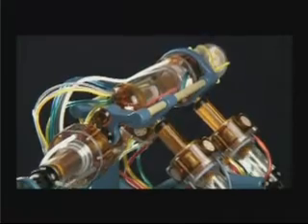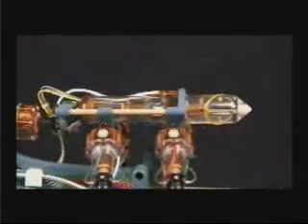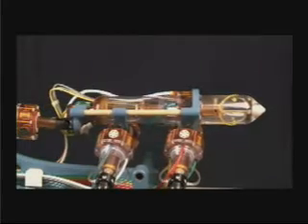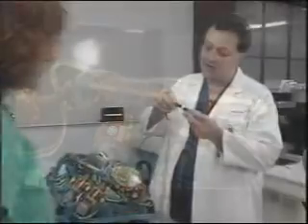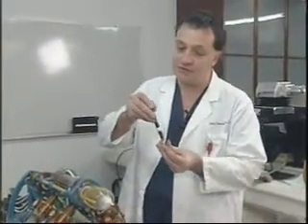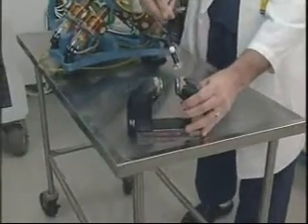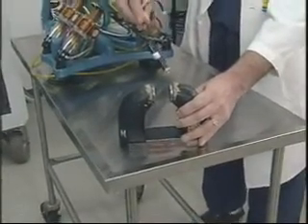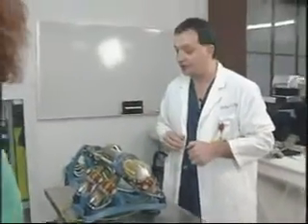Making an MRI-compatible robot is a very challenging engineering task because robots normally are made with metals and electricity. And this kind of motors right here, which are electromagnetic motors, and as you can see with this magnet, these are totally incompatible with the MRI based on the principle on which these work.